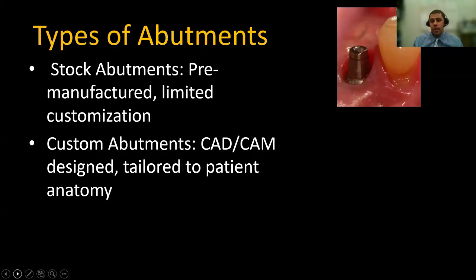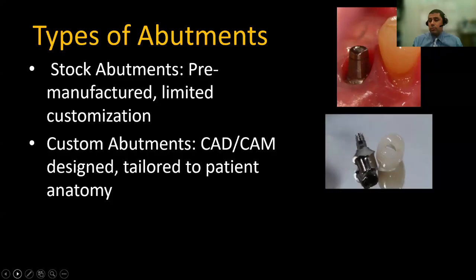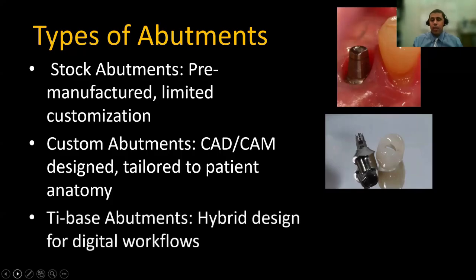And those are probably most of what we use in dentistry, at least in my practice, probably for single unit restorations or fixed dental implant prostheses. Those are what we utilize most of the time. They provide huge advantages from tissue support to tissue health, control of the location of the margin, and thus control of the cement around the dental implant, but also give huge advantage from a biomechanical standpoint, but also an aesthetic standpoint.